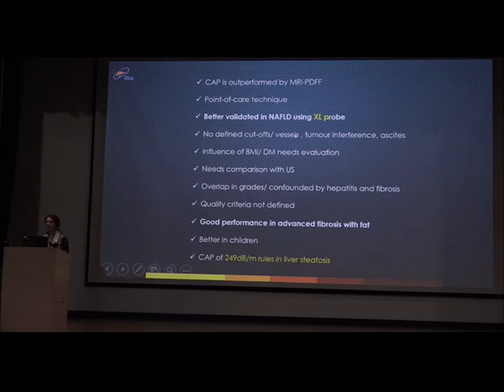Patients who are diabetic, who have metabolic disease, the values that you get on CAP are not the defined values for those patients. So that is a big lacuna for CAP. This needs comparison with an ultrasound, and there is an overlap in grading, as well as the confounding factors of hepatitis and fibrosis that affect CAP values.